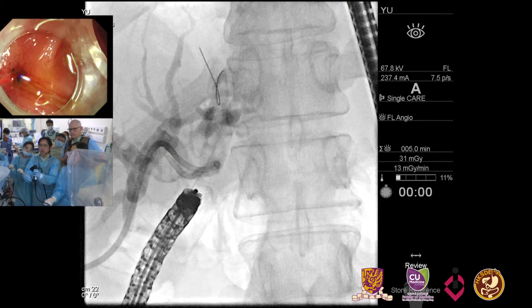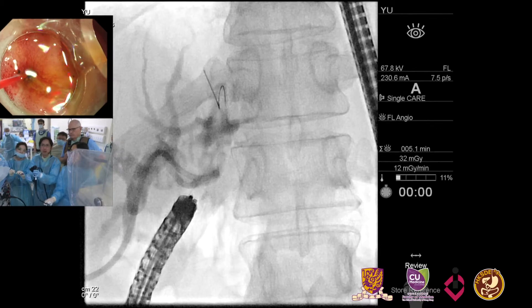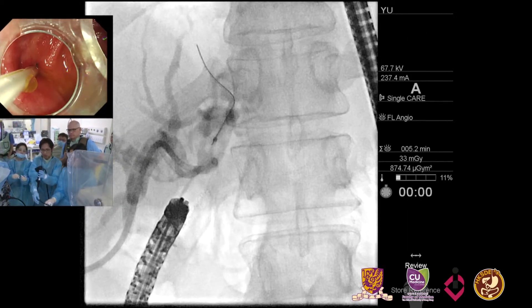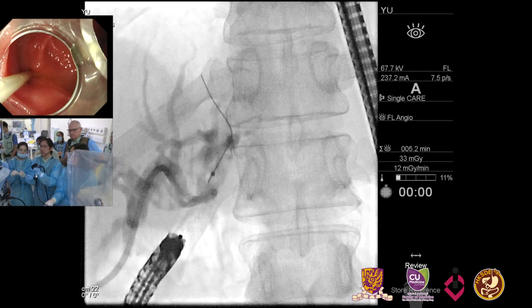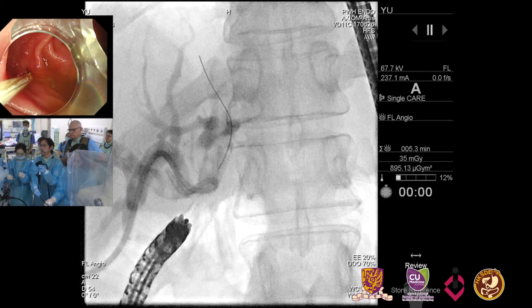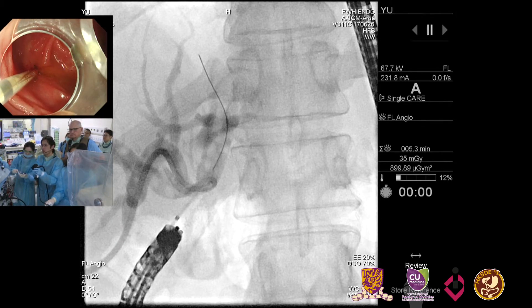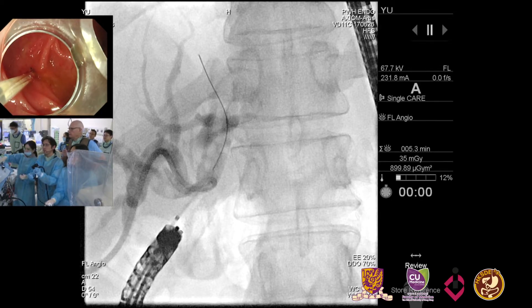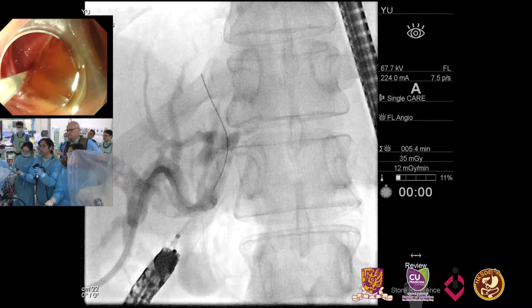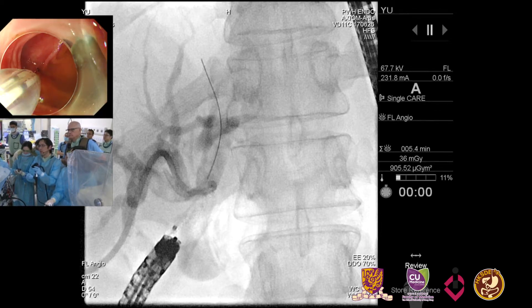I saw a recent report that for this kind of very tight stricture in a hepaticojejunostomy patient, we may consider placing an Axios stent — because of the very short configuration — for drainage and for stone extraction later. We can leave it there, dilate through it, and then do the stone extraction through the Axios stent, and then take out the PTBD. I haven't done it before. We have heard reports from other centers where, for a Roux-en-Y gastric bypass type configuration, they use an Axios stent to access the biliary system, though this is a different situation here.